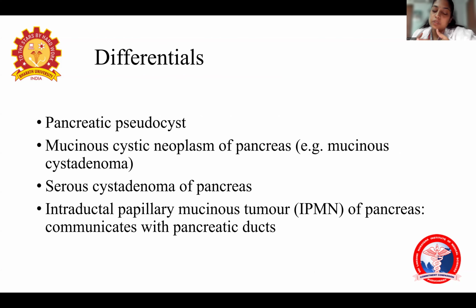Coming to the differentials of cystic lesions of the pancreas, we only have a few cystic lesions, and in the case of a pancreatic cystic lesion, we can identify most of them on imaging. In maximum 99% of the cases we can identify it on imaging. Considering other organs' lesions, you would need a HPE correlation, but with pancreatic lesions, we will be good enough with imaging alone.